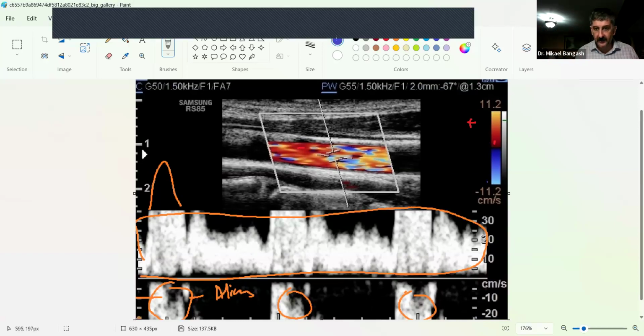You even see this color, the light blue, right? You see some traces of the dark blue. So what did that mean? That the orange color in this blood vessel that you see, which is from the extreme pole, is being mixed with some of this. You see here, here, here, right? So what does that tell you? Aliasing.